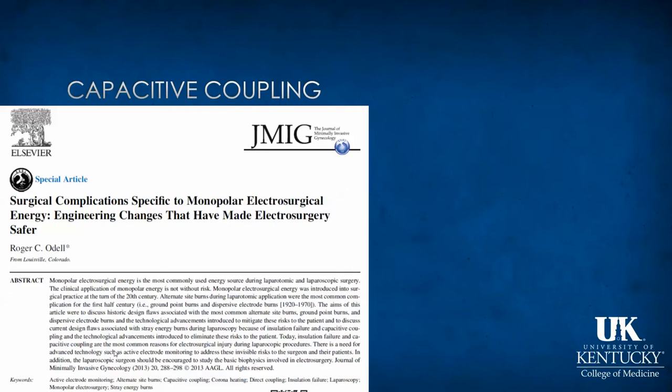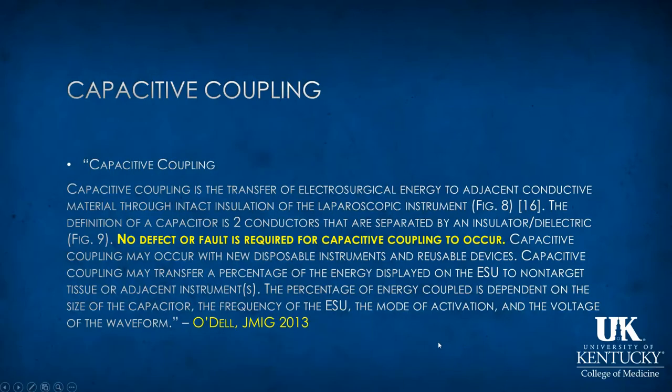So within this review, I found a few interesting things that I want to share with you, and that is that this concept of capacitive coupling describes the transfer of energy into a patient or through a patient such that a burn or tissue damage can occur.